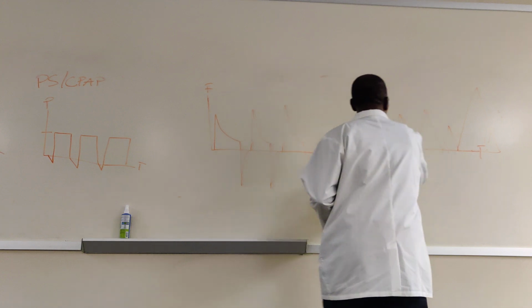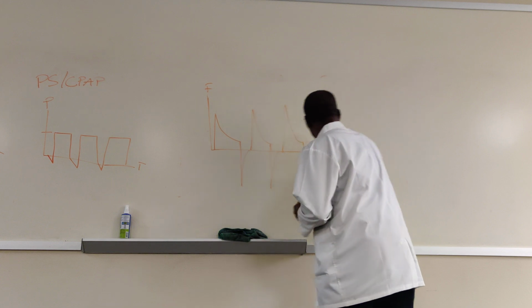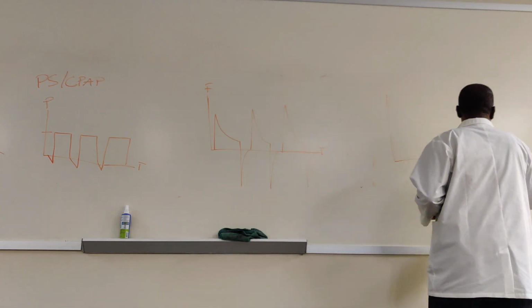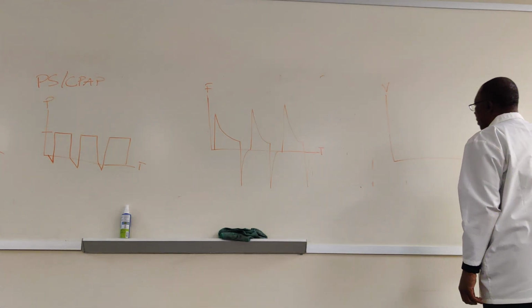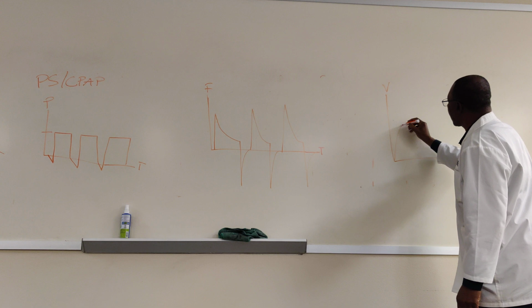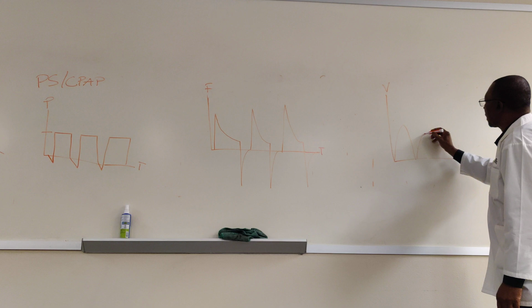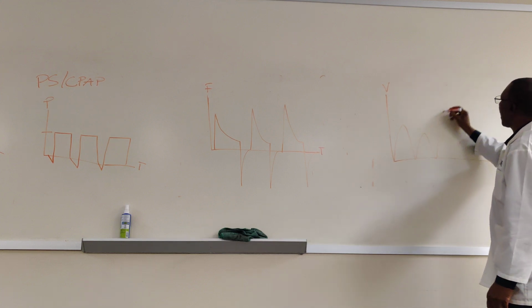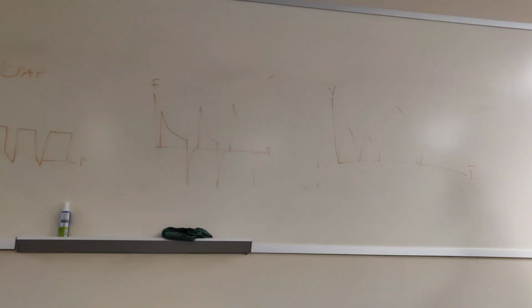And then for volume time curve, the tidal volume varies there, according to patient lung compliance and resistance. So you may see that on this breath, that on the next breath, that on the next breath, like that. The tidal volume is everywhere. Okay? Any questions about that? And then there's one more, there is a CPAP.